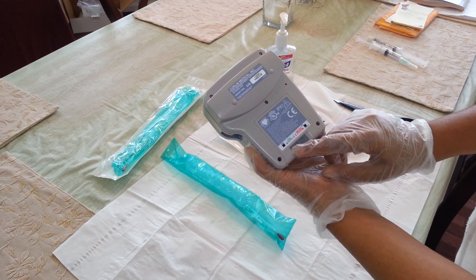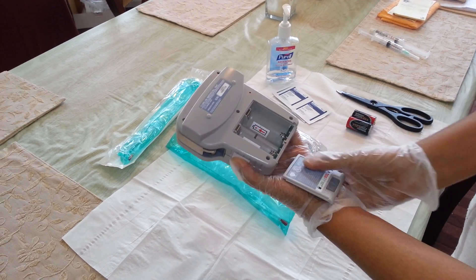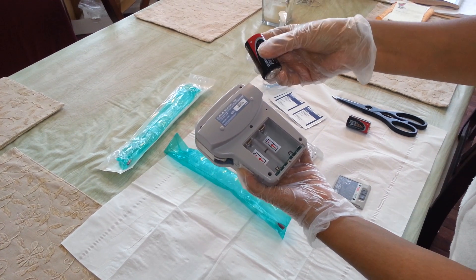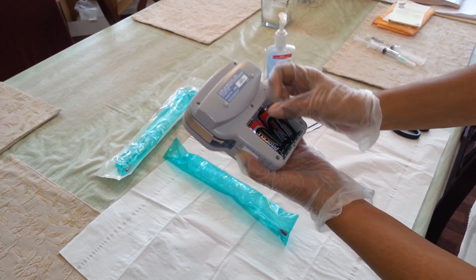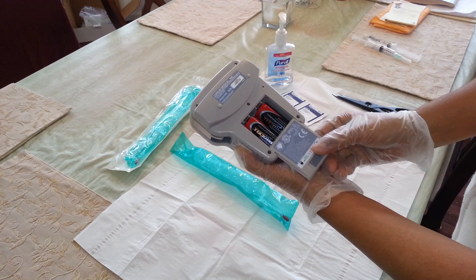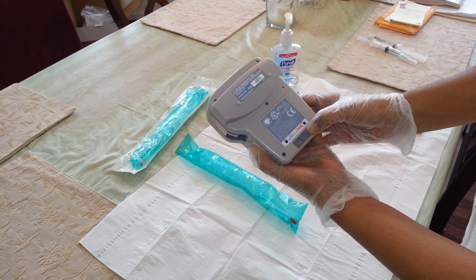Right now it is in the lock position. I am going to slide it to the unlock position and open the cover. I'll slide in the Duracell batteries, making sure that the plus and the minus signs are in the right place. Then I am going to slide the battery cover back in and slide it to the lock position.